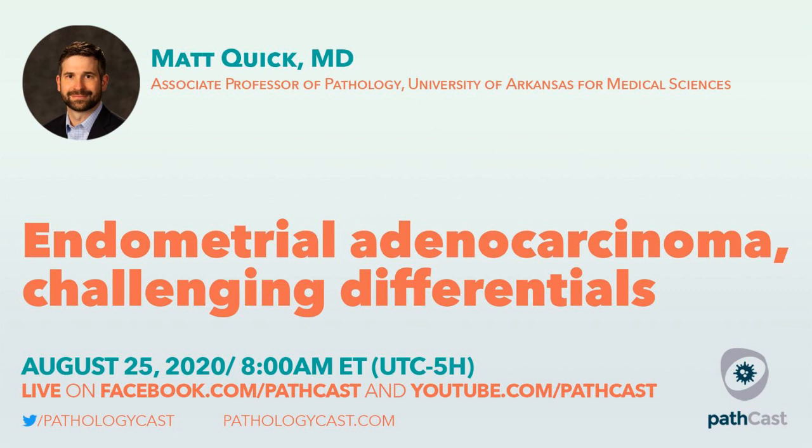Oh, that is a great question. I could write a lecture on just atypical mucinous proliferations. And so you know that you're getting ready to get an answer that's probably not going to answer your question, and I apologize for that in advance. But mucinous proliferations of the endometrium, they're tricky. When I see any kind of mucinous differentiation in the endometrium, the first thing I do is look at the complexity of the epithelium, right?